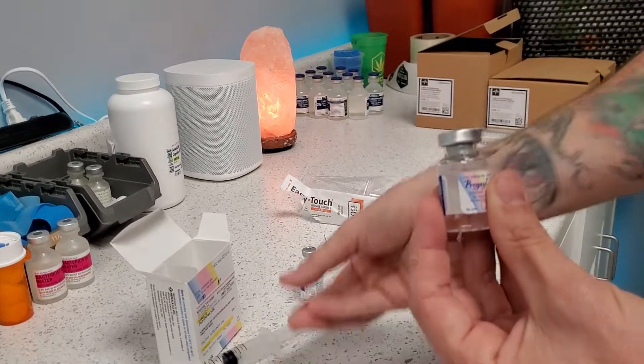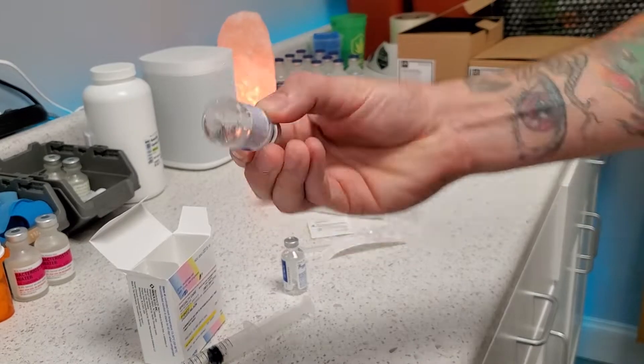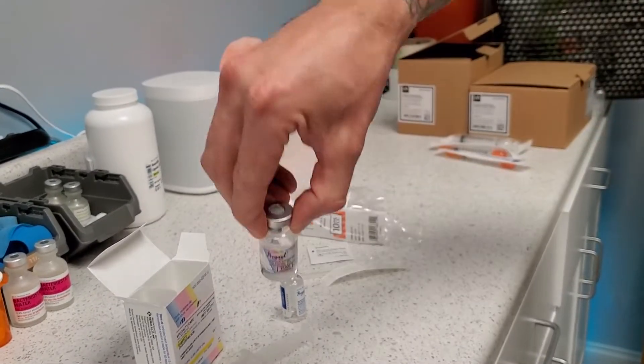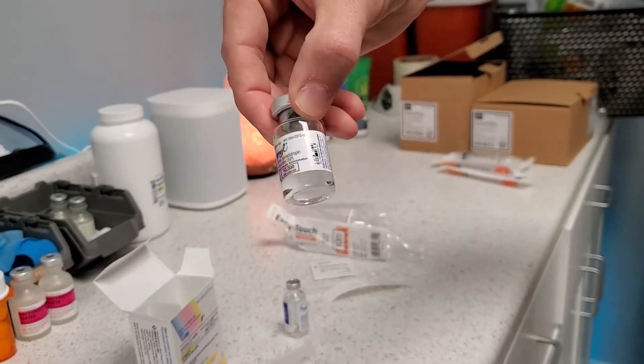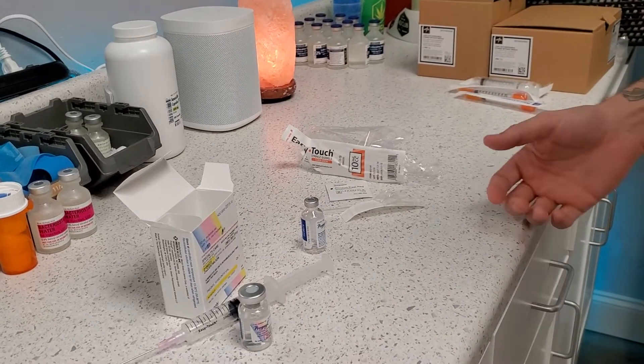Then you just remove your syringe. Flip this vial very gently, just to get all the powder dissolved. And now we're ready to go. We're going to put this in the fridge and now we're ready to use. And that's all there is to it.